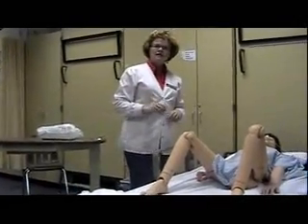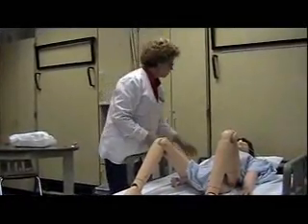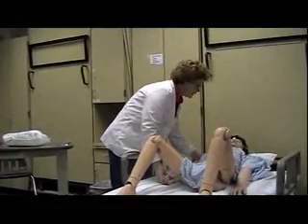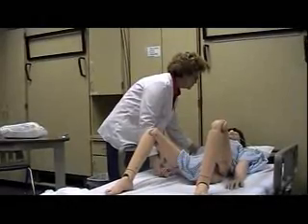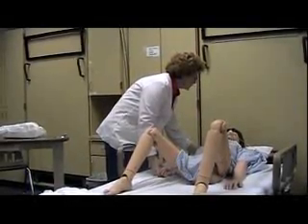The next thing you want to do is come in and introduce yourself to the patient. Hi Mary, my name is Kathy. I am your nurse today and your doctor has ordered for you to have a catheter put in. A catheter is a tube that goes into your bladder and drains the urine.